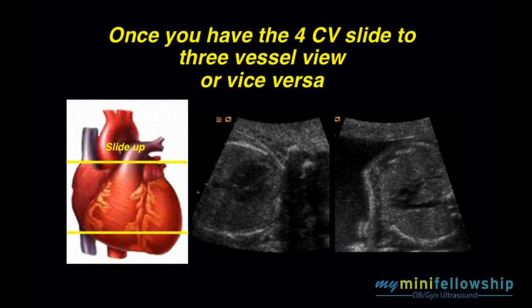Simply slide up toward the chin until you get your three-vessel view. If you have a good four-chamber view, then it's also a good time to simply angle up and get your five-chamber view, or the early left ventricular outflow tract.